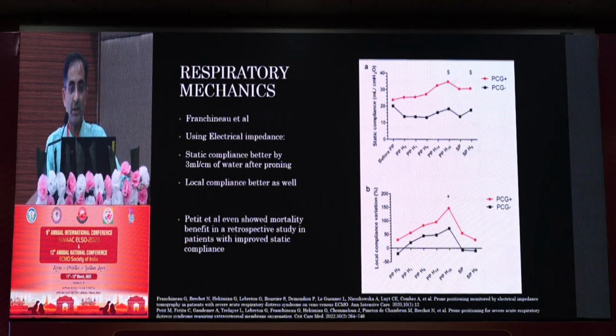Of course, assessment of respiratory mechanics is often difficult in the clinical setting, and there have been studies using different modalities such as electrical impedance, and indirectly using ultrasound or even, for that matter, CT scan.